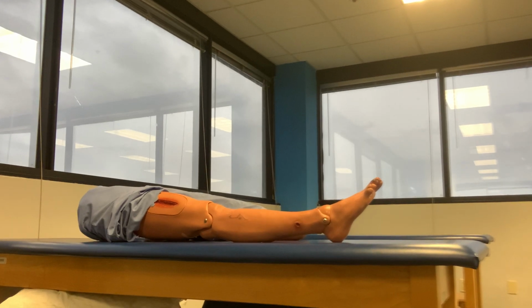Okay, so in this video, I'm going to demonstrate how to apply the intermittent compression machine. So with our patient, we would have our patient in the waiting area. We would take their blood pressure so that we know what we're going to set this patient's parameters to. Just a reminder, if we were treating this patient's upper extremity, we would use the range of 30 to 60 millimeters of mercury for the upper extremity and 40 to 80 millimeters of mercury for the lower extremity.